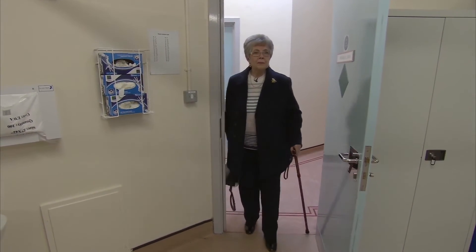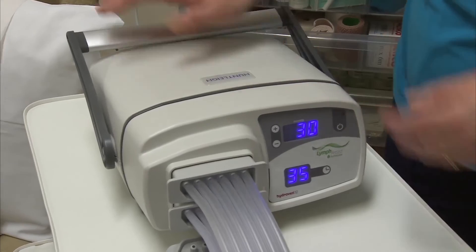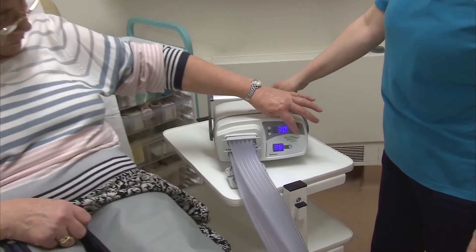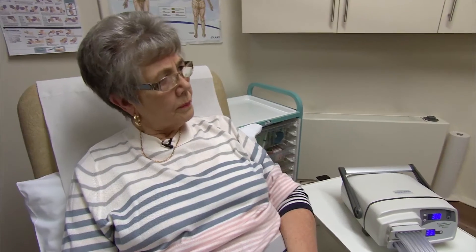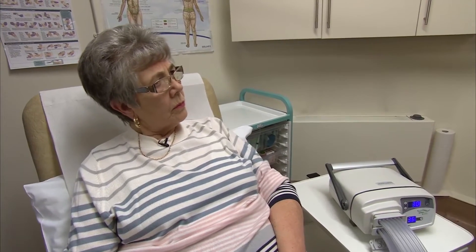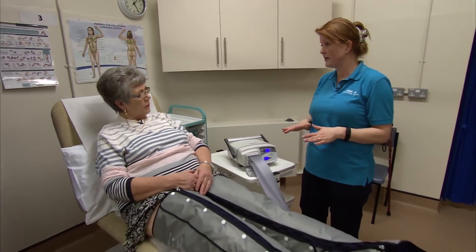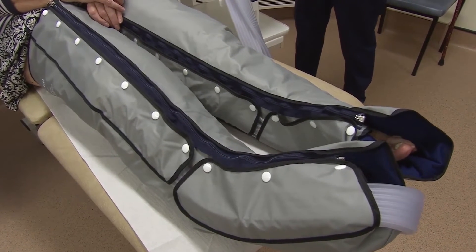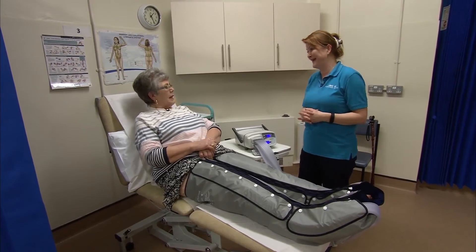Rosina has been coming to the clinic weekly for treatment and is now going to try using a machine at home. All the settings are set up for you — all you need to do is press the button where it says start. During the treatment, it's beneficial to take a few abdominal breaths as well, to clear the middle lymphatics. Make sure your skin is clear, it's not cut, and you haven't got any signs of infection — redness, pain, or heat. When you're feeling unwell, I would not advise to use it. If you have an infection, go straight to your GP.